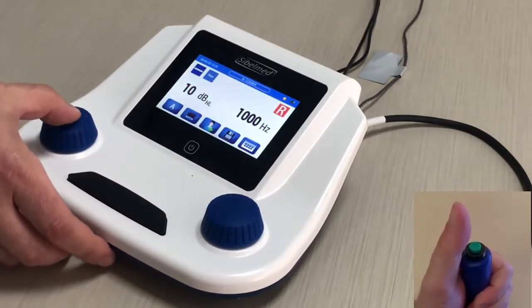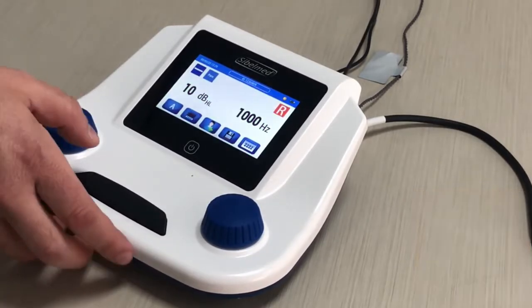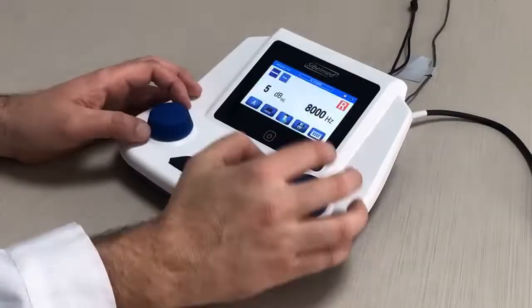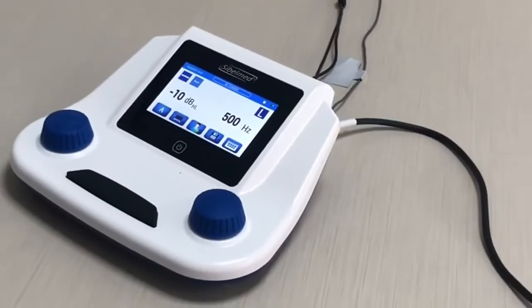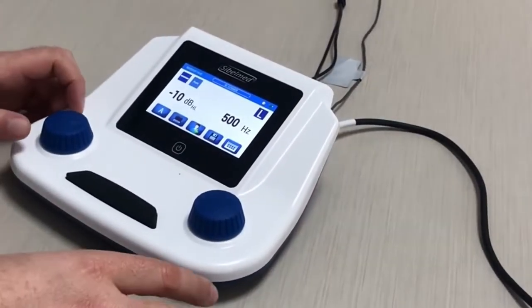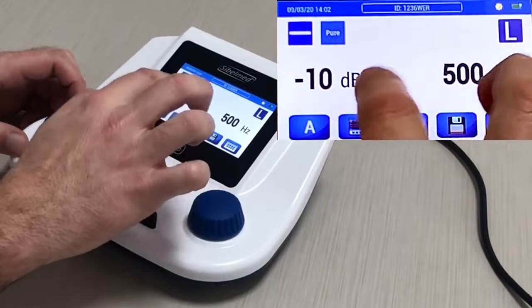We can verify with the icon whether the autosave function is disabled. We will check all the other needed frequencies. We have finished the test, so let's go to see the results.